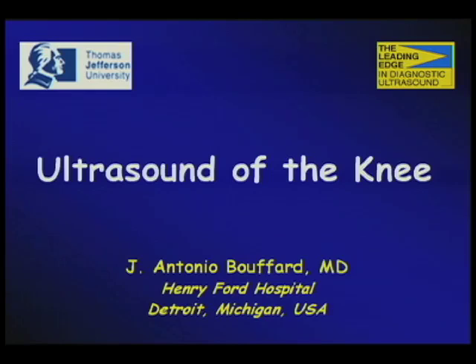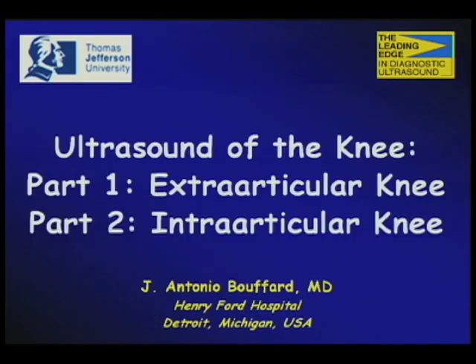This is a modular approach on ultrasonography of a joint wherein we start showing first the anatomy and how to routinely explore the knee, and after that we go talk about pathology. And this part will combine some of the anatomy and pathology of the knee. But in particular, we're going to look at the intraarticular portion of the knee.